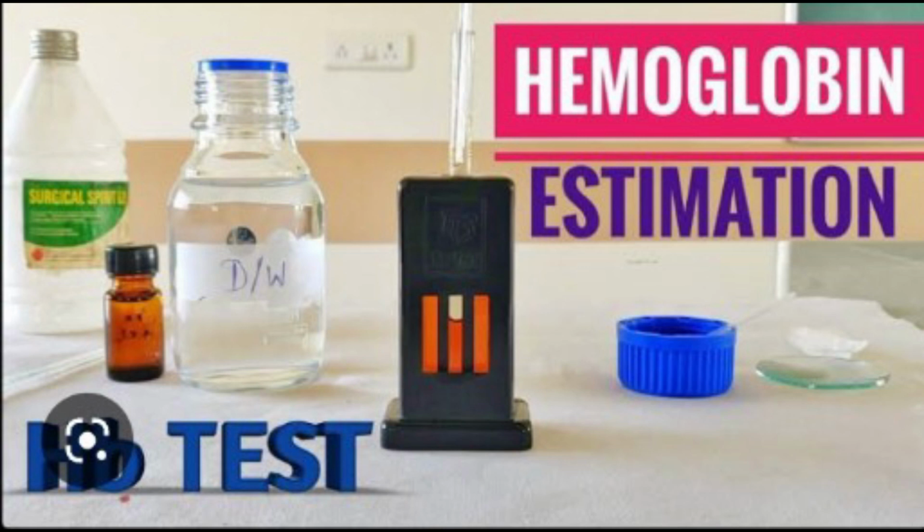A drop of blood is collected by skin puncture and taken into a long-necked Pasteur pipette, and then immediately dropped into the proper copper sulfate solution. Observe for 15 to 20 seconds. If the person is normal, the drop of blood will settle down, and if the person is anemic, the drop will float on the top. This test does not give the exact amount of hemoglobin. This technique is usually applied in blood banking for screening donors. It is a quick, easy, and accurate technique.